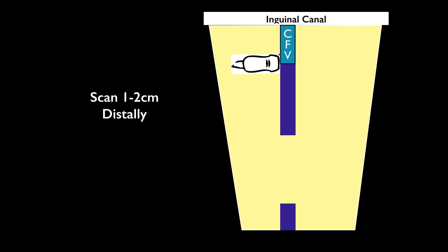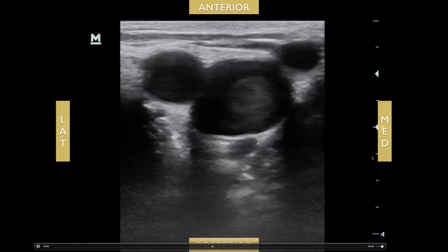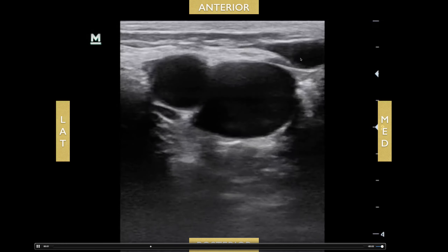As you slide the probe distally about one to two centimeters, you'll see the junction of the common femoral vein and the saphenous vein. The saphenous is considered a superficial vein; however, we still scan for it sometimes because there might be a clot right at that junction that can eventually lead to deep vein thrombosis. If I can, I'll try to look for the saphenous vein — not mandatory, but nice to look for. You can see it coming right off the medial side of the vein.